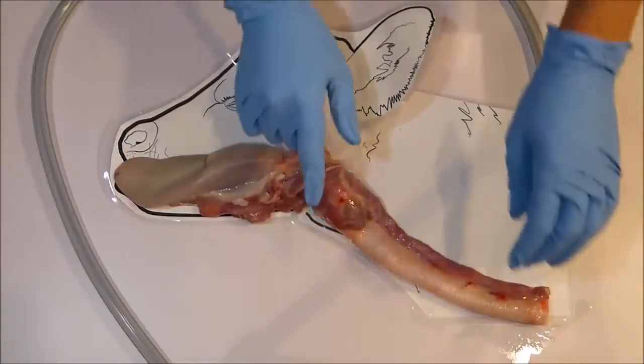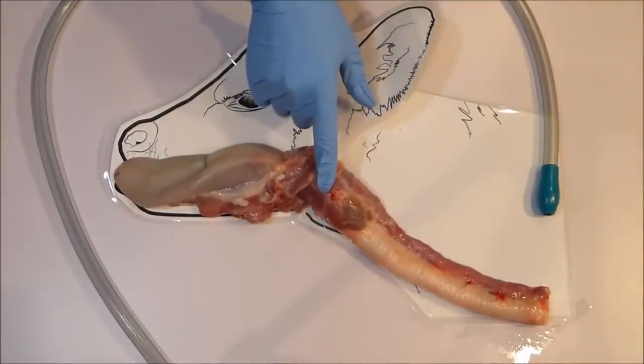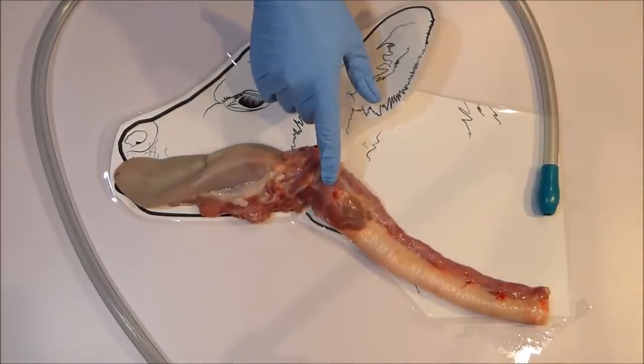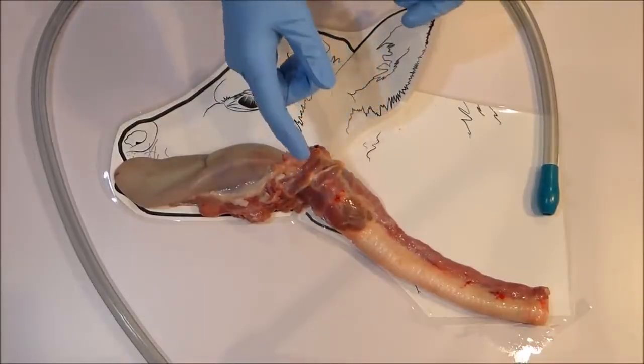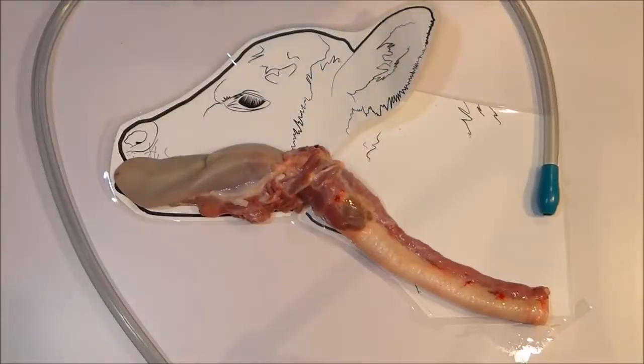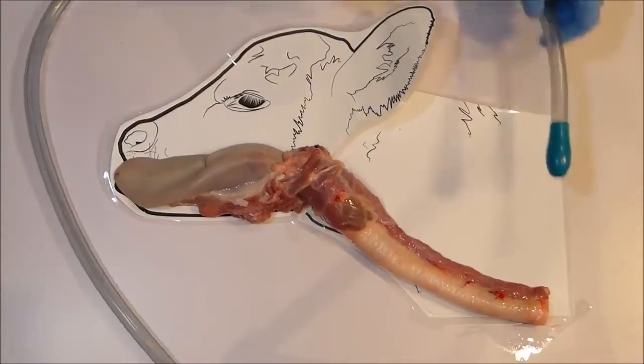The entrance to the airway is here. This is the only entrance and the only way milk or liquid can access the lungs. Fortunately for us, there is an excellent system designed here so that in a conscious animal it is far easier for solid items to pass into the esophagus than into the airway.